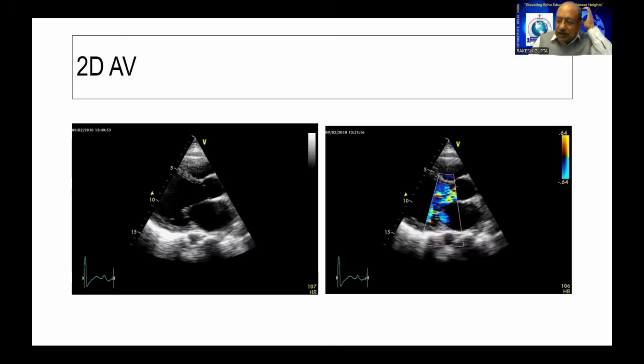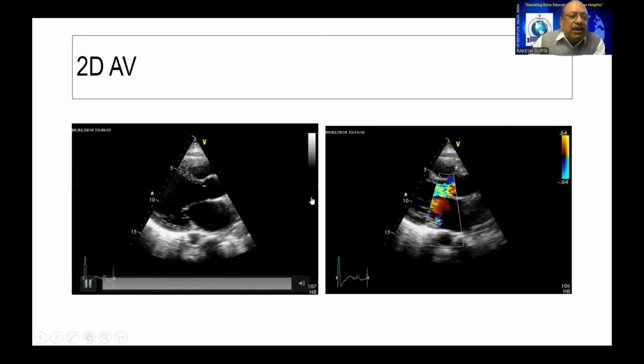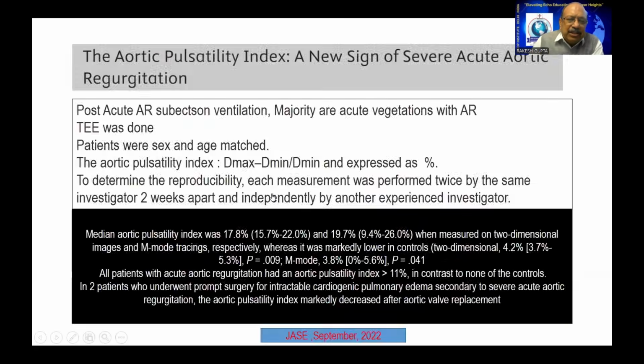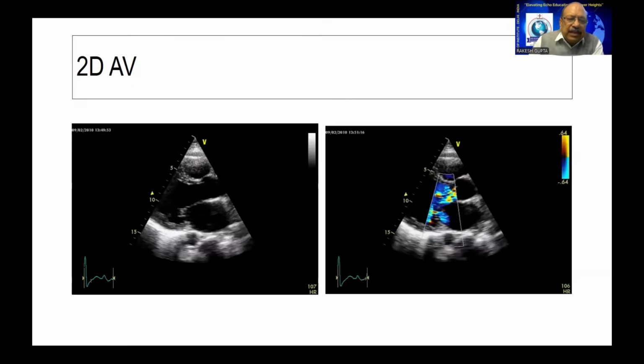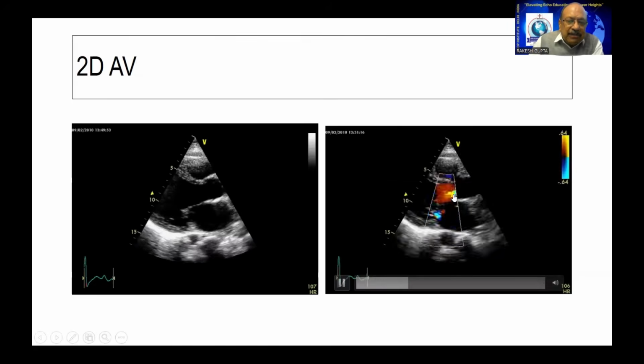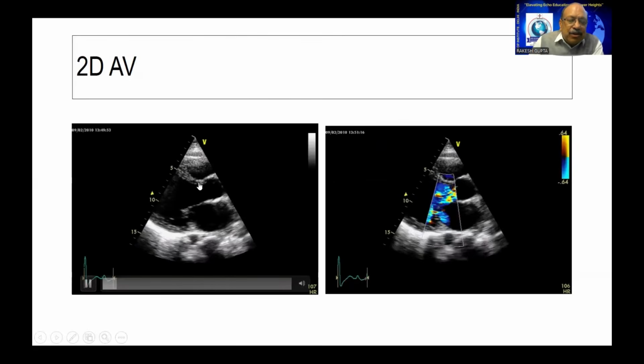Here is a patient who just walked into our lab, a young boy, 30 years old, running fever for the last couple of months. He just walked in and said, I'm having chest pain. When we did an echo, what is very innocuous? You see a vena contracta is almost 7 millimeters over here. And right coronary cusp is seen, non-coronary cusp is not seen.